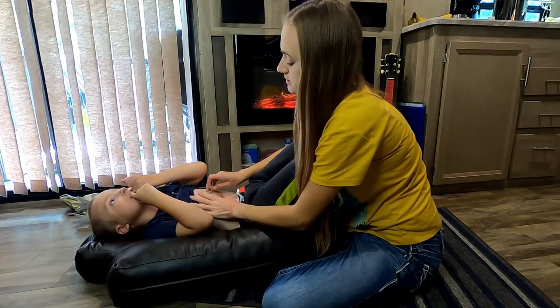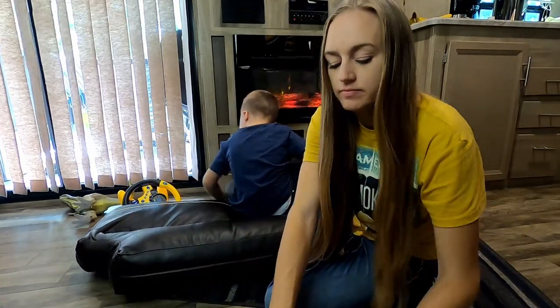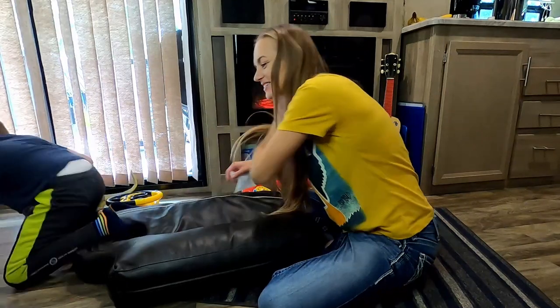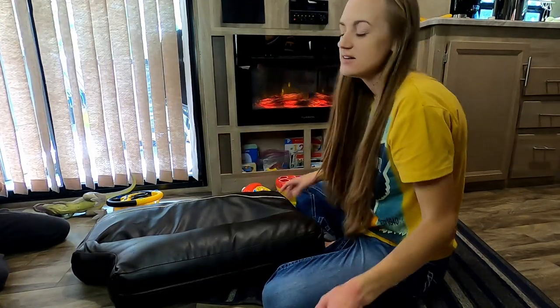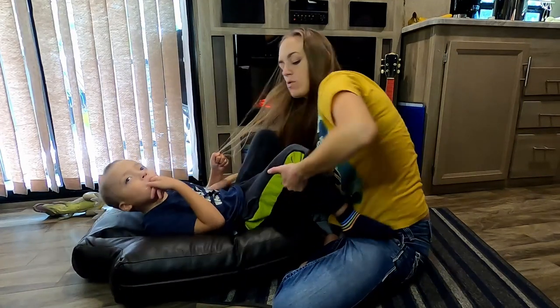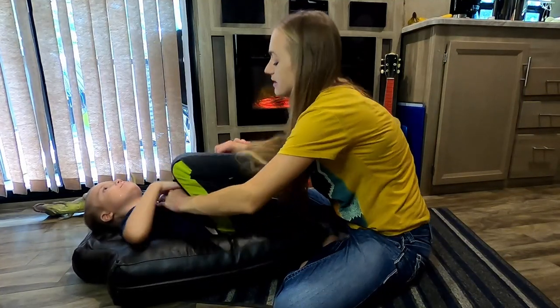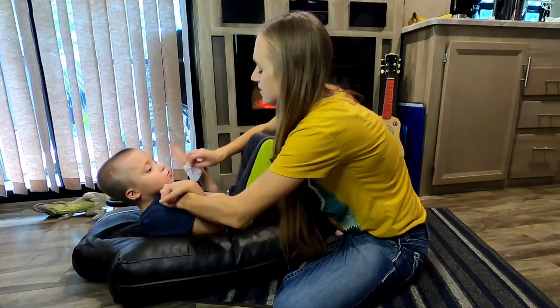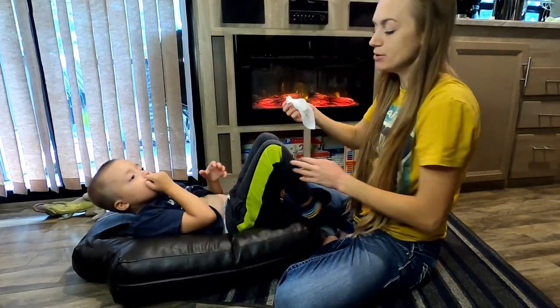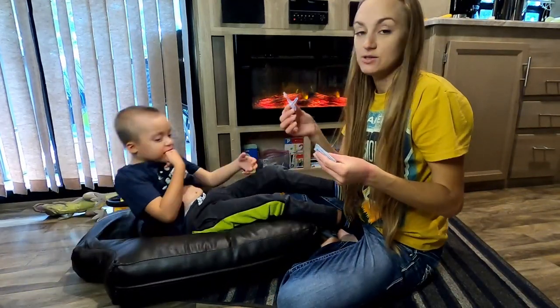All right, so we're gonna take out that button. Look at that, and some nice goo comes out. As you can see, I didn't have to pull super hard, but it did come out. That feel funny? Okay. Ready? So then I just take a wet wipe. I'm just gonna tickle your tummy and I'm just gonna wipe. All right. Boom. Done. So now we need to get the new button in.